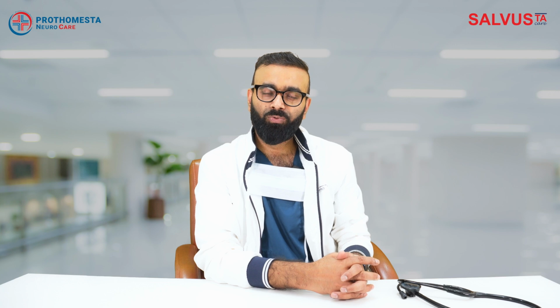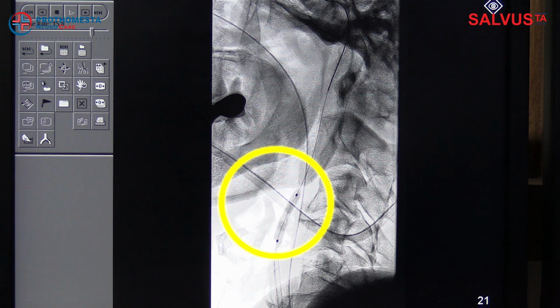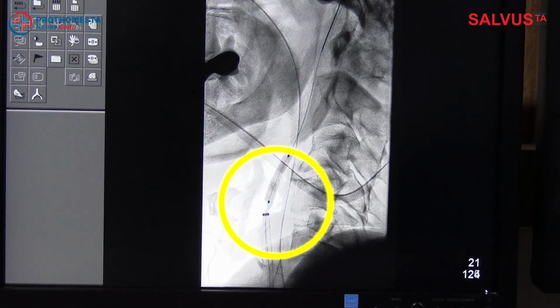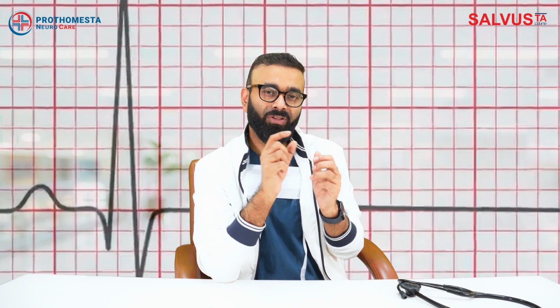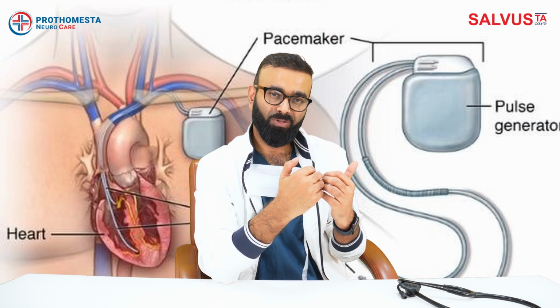After placing that one, we do some balloon plasty from inside. There is nothing from outside. All the things are being done from inside, and we reach over there. We do balloon plasty, and if it is a very tight stenosis, we do gradual plasty using different sizes of balloon. During balloon plasty, there can be a partial impact on the heart, slowing the heart pumping. In medical terms, it is called bradycardia. We need to be very careful regarding this one, and that's why sometimes a temporary pacemaker is also placed.